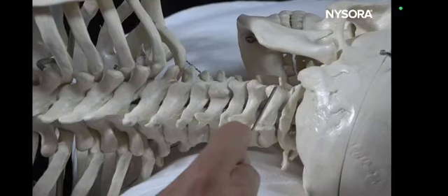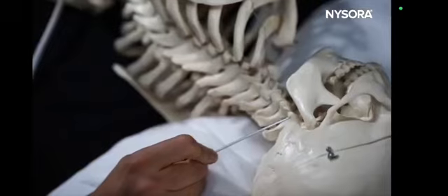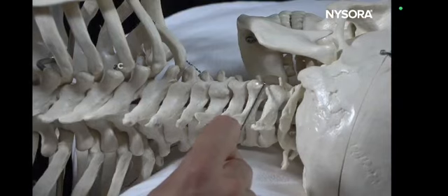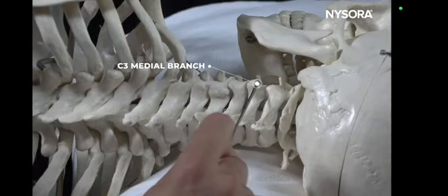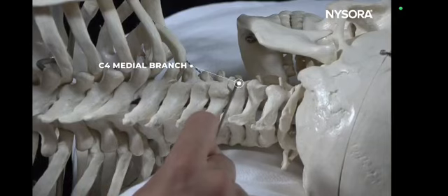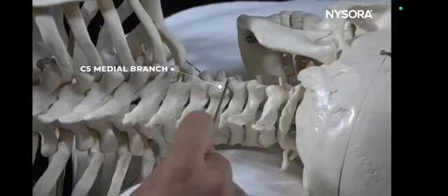At the C2-C3 joint, the nerve structure that's located superior to the joint is the third occipital nerve. Then you have the peak, which is the C2-C3 joint, and you have a trough, which is where you will have your C3 medial branch. Then you have your C3-C4 joint, which is a peak, and then a trough where you have your C4 medial branch.